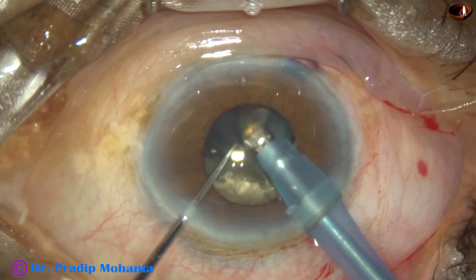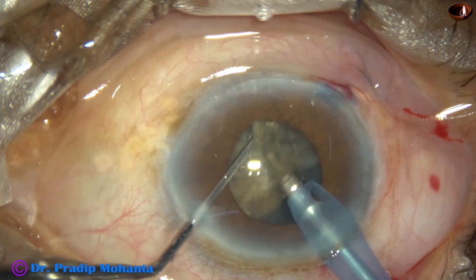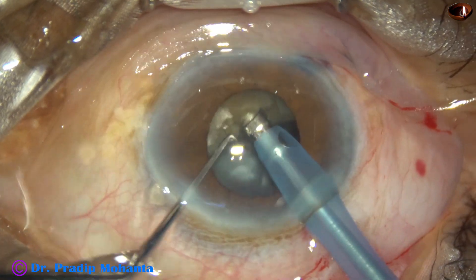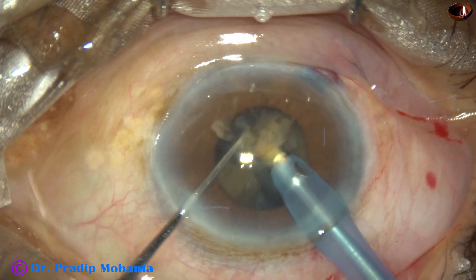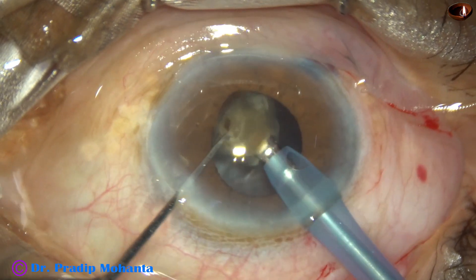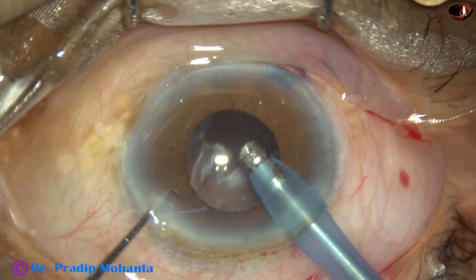We are almost done with the one hemi-nucleus and now we come to the other hemi-nucleus. These fragments are not free — they are joined centrally. So I tilt it and go to the apex. As I apply some ultrasonic energy at the apex, the pieces become separate and we can manage those pieces easily. During emulsification of the last piece, I decrease the vacuum and flow rate, and it is done.